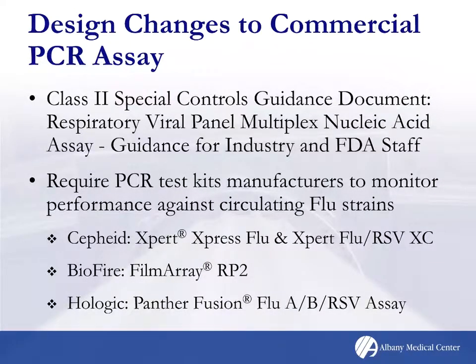Because of these changes, commercial manufacturers are required to monitor their tests for mutations against the circulating influenza strains. And because of it, 3 manufacturers have modified their assays to address these concerns, or it is part of the reason why they've made the changes.